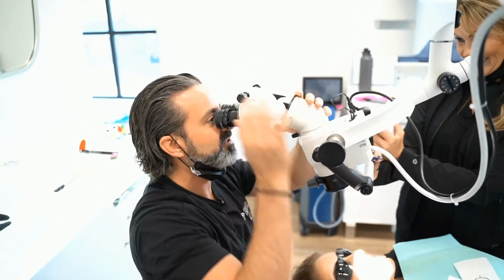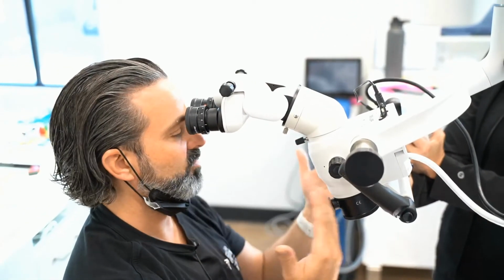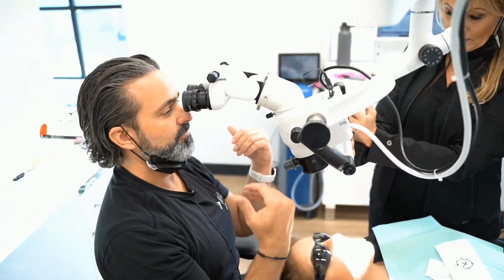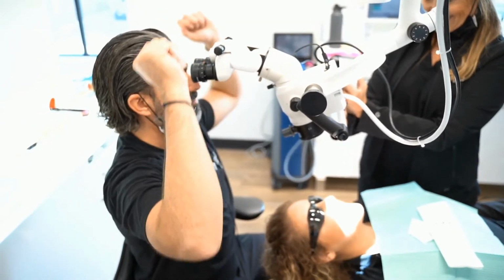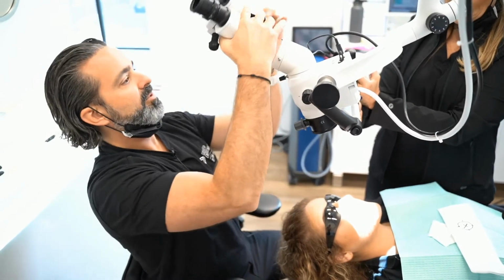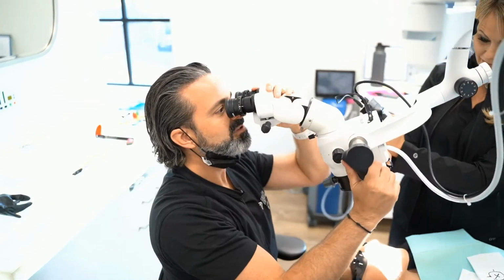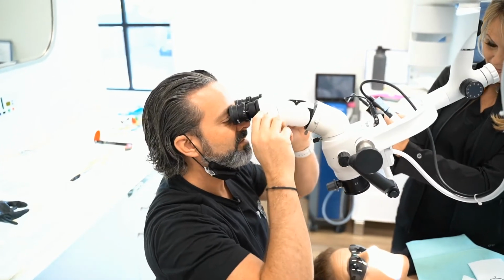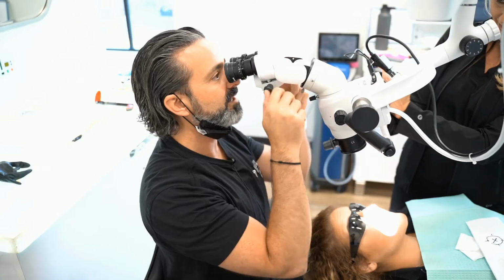Okay, so now I'm back into this right here. This is just a better position where I'm leaning more, almost more reclined, and that is really helpful for me and my body posture. But I'm still lifting my arms up. Again, I want fantastic shoulders for different reasons, but I don't want to do military presses for a living as a dentist. So if I were to take this off and flip it around, now look at my shoulders, look at my arms. See how they're tucked down? This is a lot less distance to travel and a lot more comfortable.